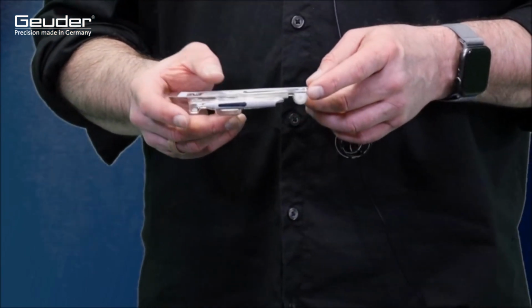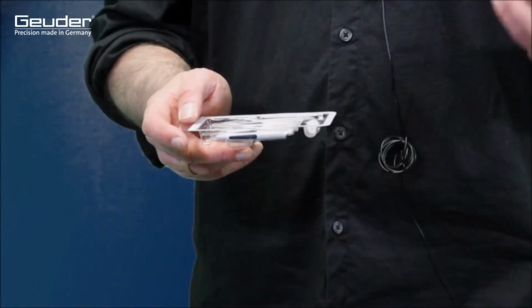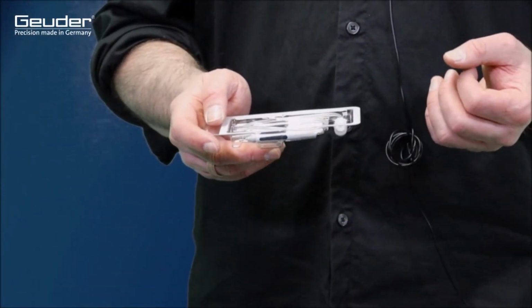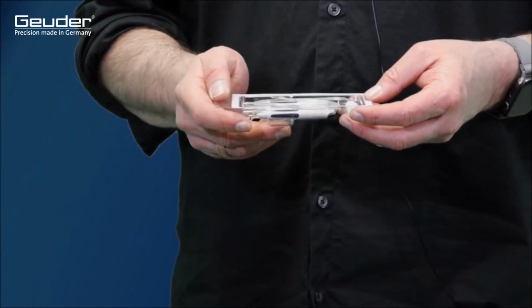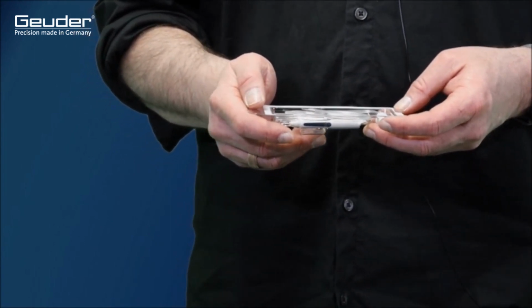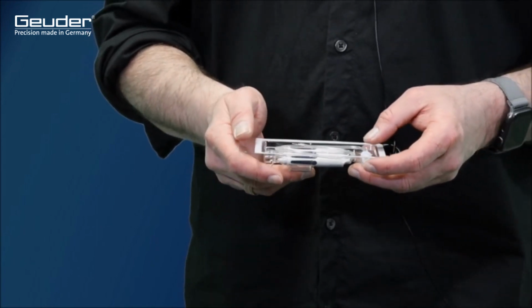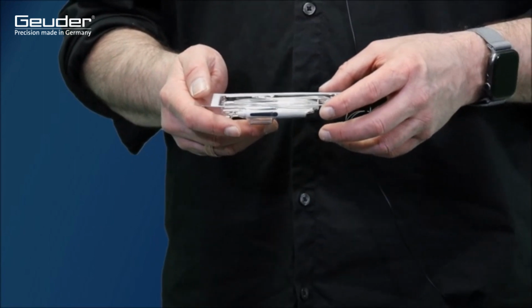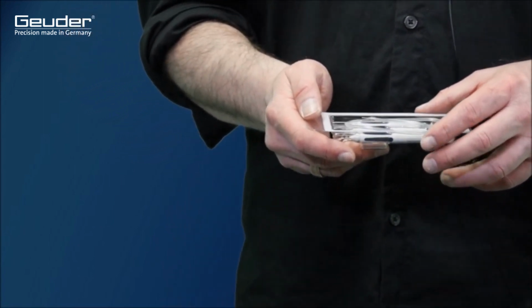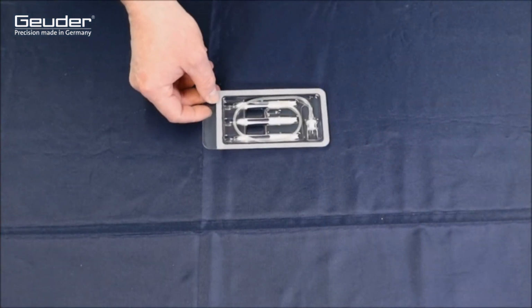The trocars are positioned in the area of the pars plana, a structural section of the non-seeing retina that lies between its outer edge and the ciliary body and contains neither larger vessels nor fundamentally important functional tissue. The pars plana is about 3.5 to 4 mm away from the limbus. Measuring marks on the proximal end of the trocar lance are used to mark the position of the trocar ports.